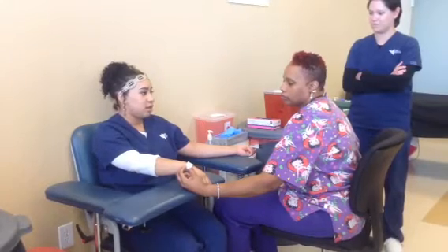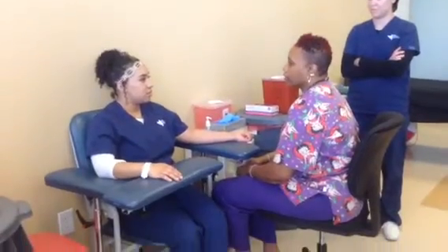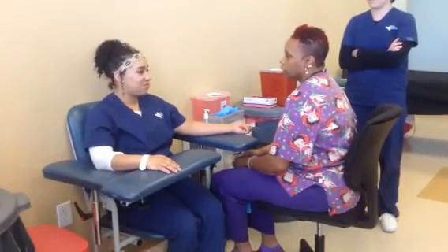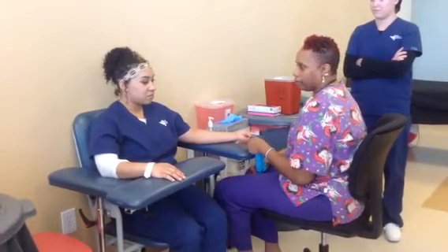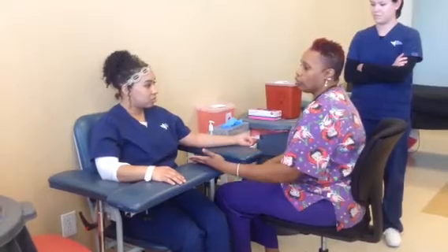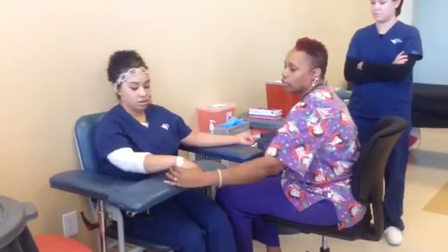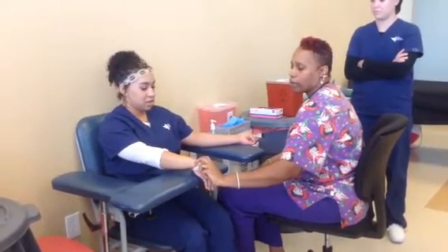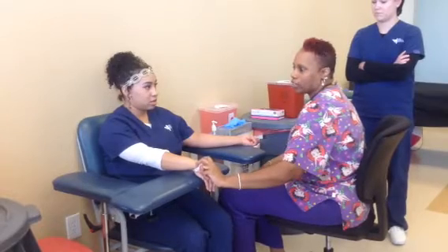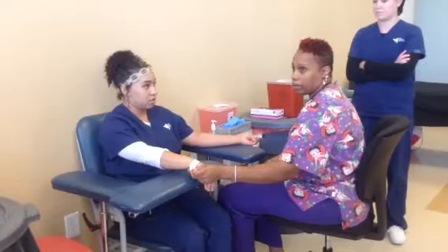Date of birth? November 3, 1991. So I'm introducing myself to my patient, letting them know I'm from the lab. Then you want to ID your patient — they tell you who they are. Just because they say they're somebody, you actually want to make sure that you look at the armband. She says she's Monique Luna — I need to actually have her spell that for me. It needs to match. Birthdate needs to match. If it doesn't match, then that's not my patient.